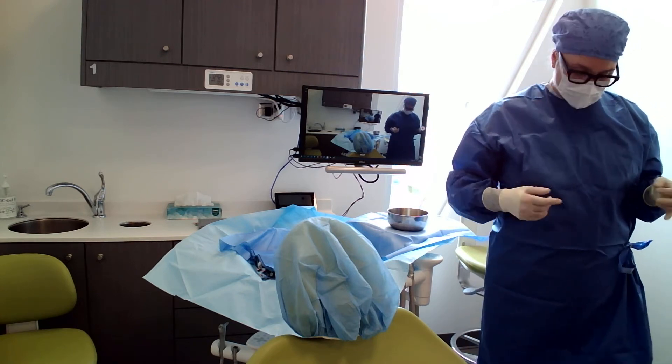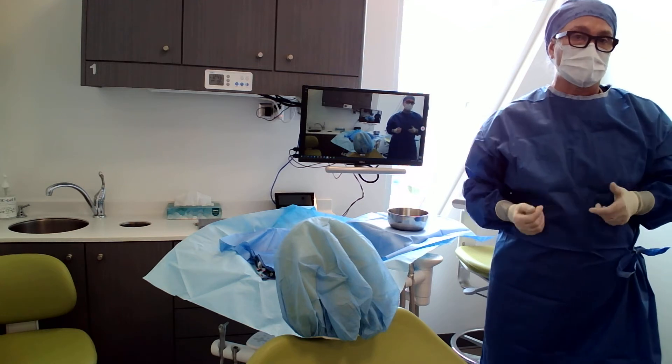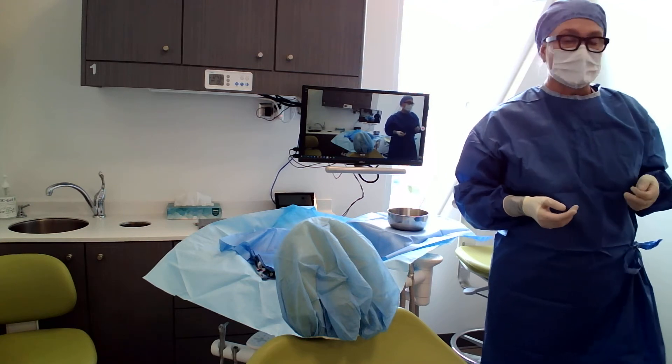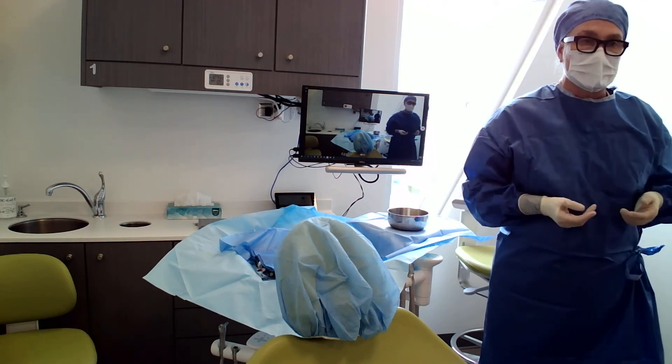At Dr. Martinez's, we use disposable sterile gowns, but we also have gowns that we can launder and sterilize — that's what they use in the hospital. A lot of the drapes are reusable and re-washable because we're trying to minimize waste.